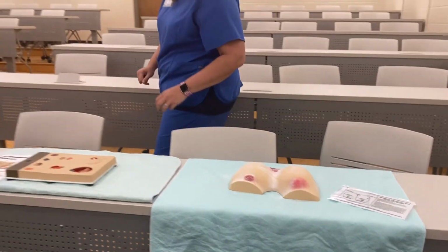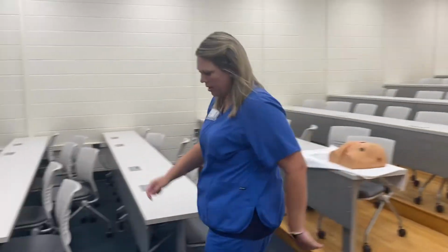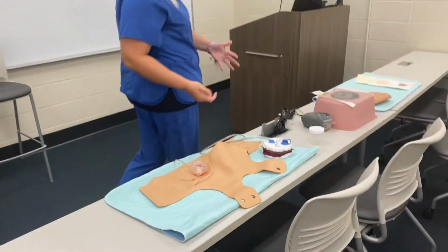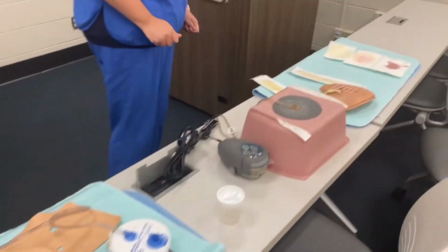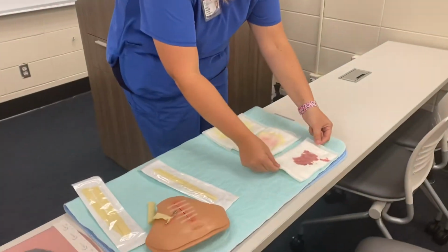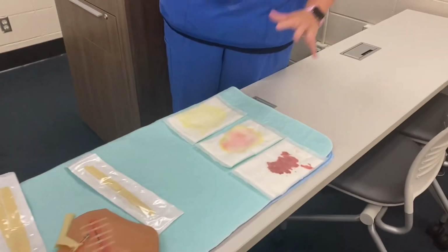All right, next we're gonna move over to our other station, which is right down here. And it's just some of our different drainage devices that y'all talked about today. So it'll get you have the knowledge, and now you get to come in and you get to play with them. So these here, if you can see those, are your different types of drainage, just a real life example.